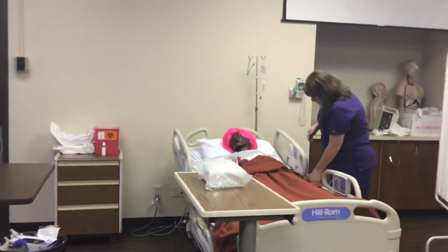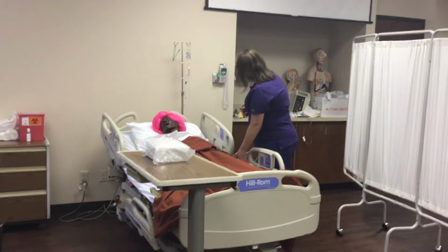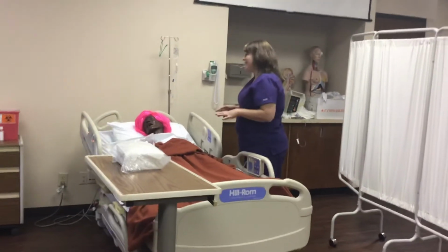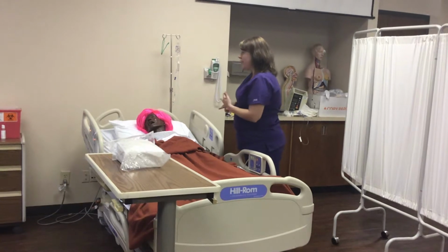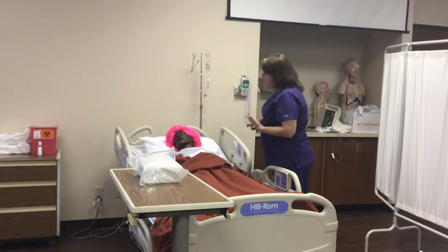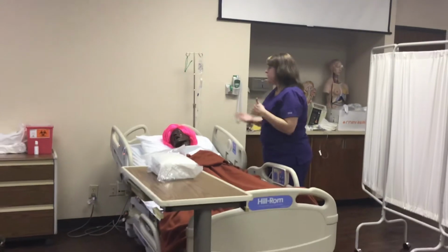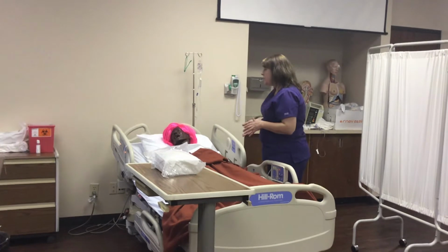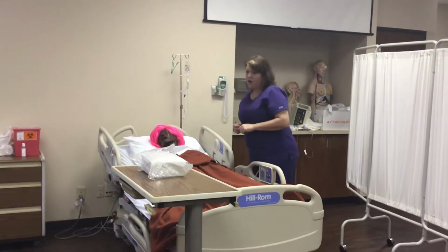If you could, please verify your name and date of birth for me. All right, perfect. Thank you, Mrs. Shelton. All right, now, I know you've also been asked this 1,000 times, but can you go ahead and let me know if you have any allergies? Okay, so no known allergies to latex, betadine, or adhesive? Okay, perfect. Okay, and you understand why we're doing the process today? Okay. And do I have your verbal permission to go ahead and get started and insert that Foley catheter for you? Okay. All right, great.